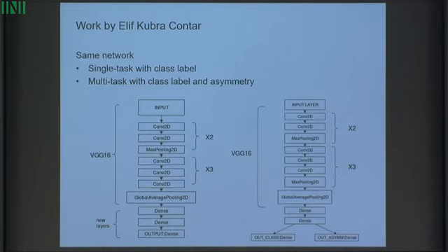So instead, we looked at whether we could use these characteristics on the output side and train a network, because then for a test image we don't need to have these measurements to predict the label. So we compared 2 networks. The network is exactly the same, except in the end the baseline network just has the single output, which is melanoma or not melanoma, and then we compare it to a multitask network, which, next to predicting melanoma or not melanoma, also tries to predict these asymmetry, border, and color ratings.